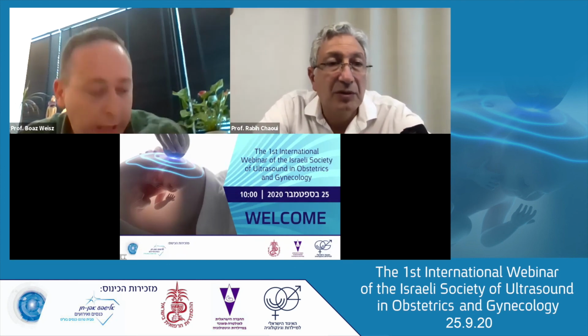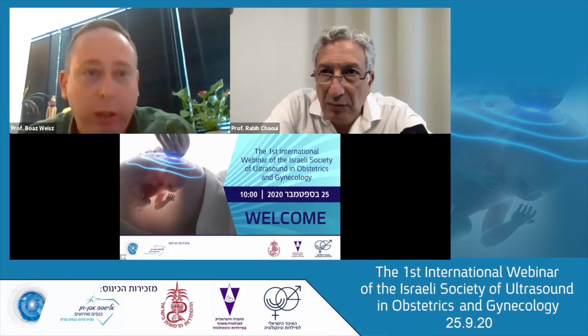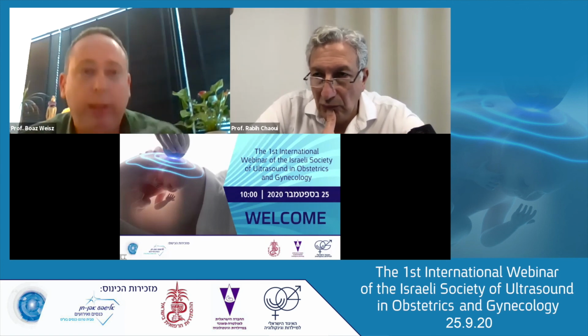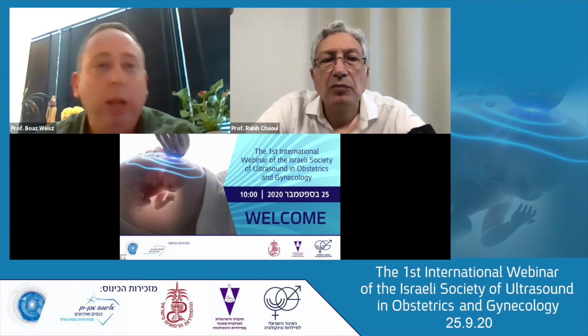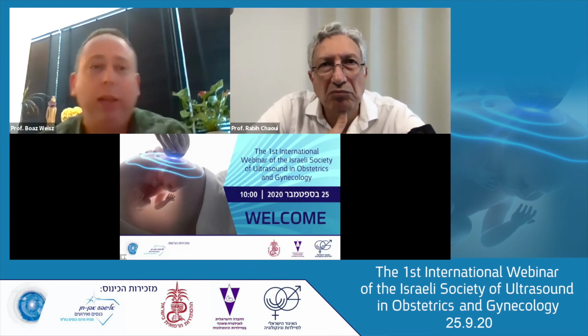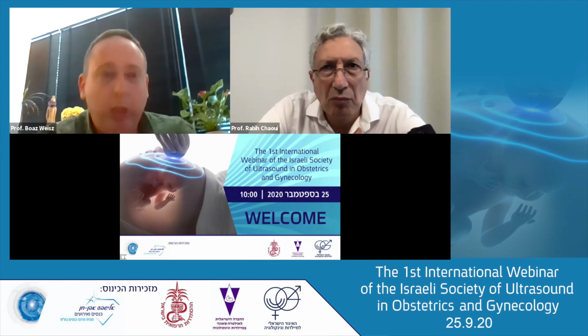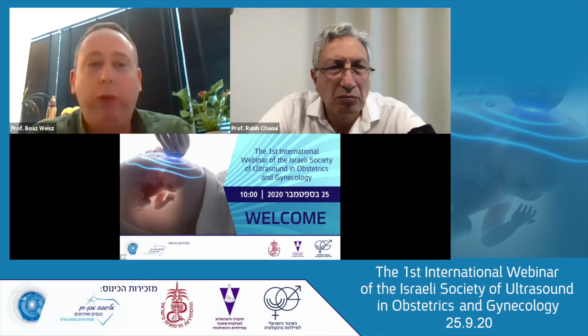Thank you. Another question was regarding the first sign of pulmonic stenosis that you showed at the beginning of the lecture, as a sign for Fallot pulmonic stenosis. I think it was a slide from early gestation. Do you think it's a prognostic sign for the pulmonary arteries later on in Fallot?